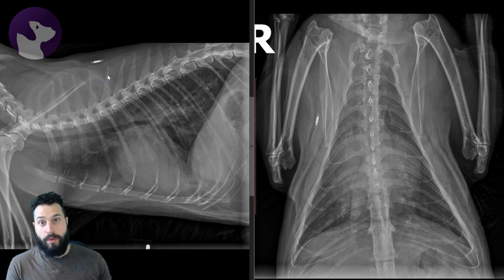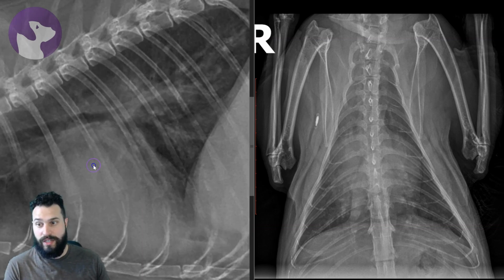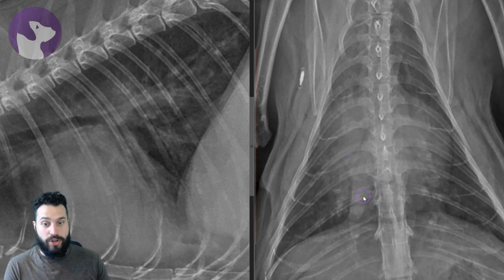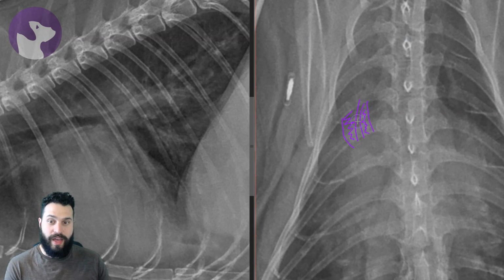So what is that pulmonary change that we're seeing? Well, it's a multifocal, unstructured interstitial to alveolar pattern. We've got this increased opacity cranially, as well as in the perihilar region that is partially obscuring vascular margins in most instances, and in some regions forms some small air bronchograms, like here in the right cranial lung lobe. So again, outlining that region, there's soft tissue here, and centrally, this tubular lucency, that's evidence of an alveolar pattern. There's edema within this region of the lung, and then all we're left with is that air-filled bronchus.